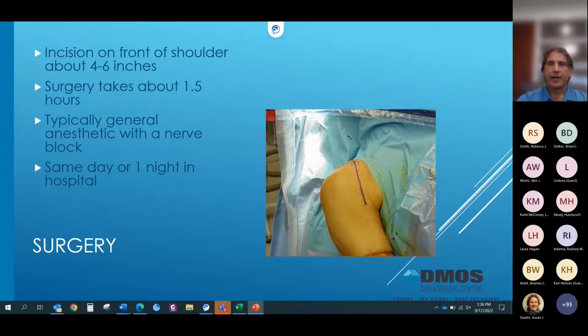Once we get those two big muscles pulled apart, then we're looking at the subscapularis, which is a very important part of the case. So to get to the shoulder joint, typically you have to release the subscapularis either off of the bone or in the mid part of the tendon, or some people actually take a chunk of the bone that the subscapularis is attached to and reflect that back so you can do your work. And then the important part is getting that to heal afterwards. And that's why we're so careful with the subscapularis management afterwards.